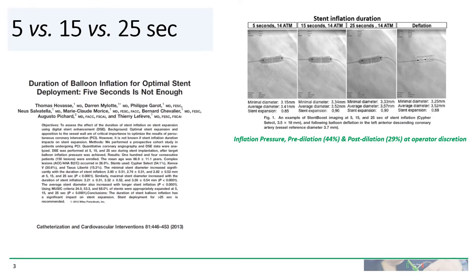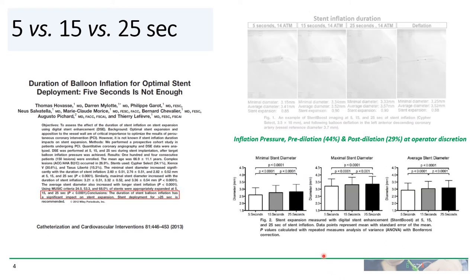There have been a number of papers published looking at this question. Back in 2013, Thomas Hovas and colleagues looked at 104 consecutive patients where they looked at stent expansion at 5 seconds, 15 seconds, and 25 seconds using digital stent enhancement technology and measured the average stent diameter. And they found that stent diameter uniformly increased the longer you kept the balloon up. 15 seconds was better than 5 seconds, and 25 seconds was better than 15 seconds.